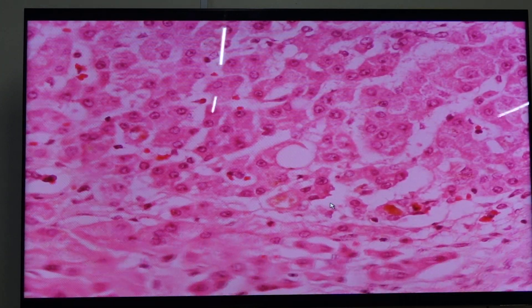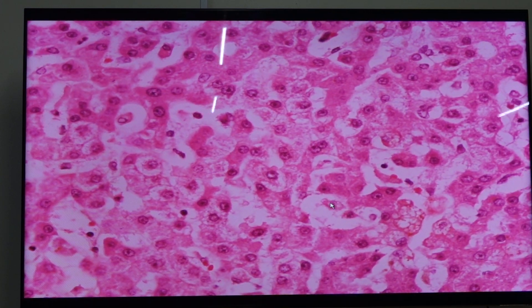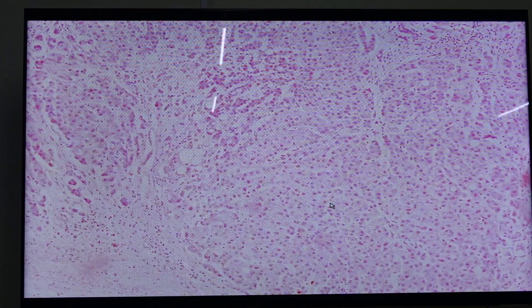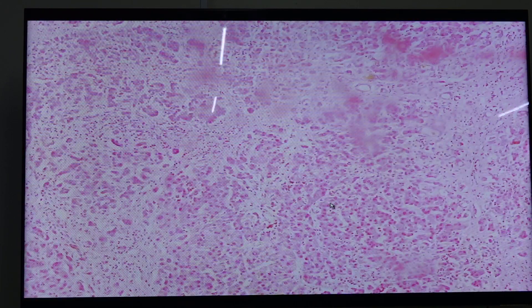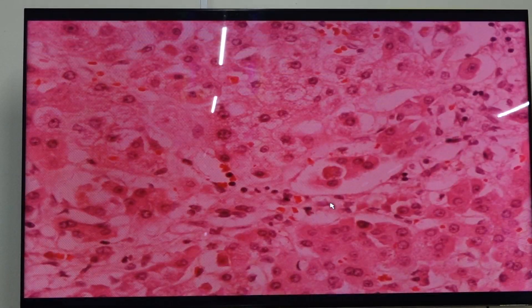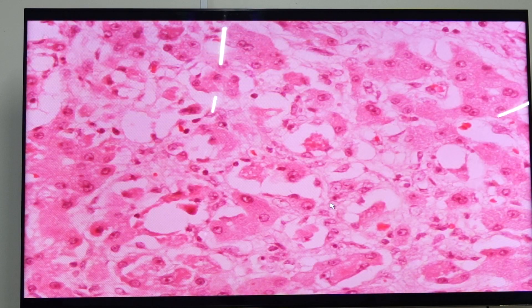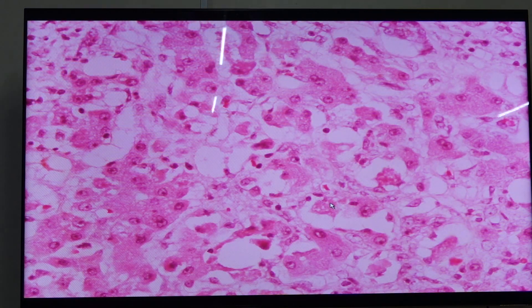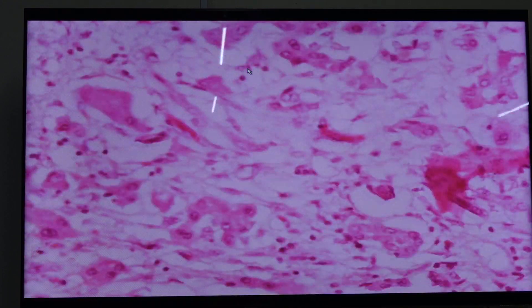The last feature for the second stage is Mallory-Denk bodies. Let's try to look for a Mallory-Denk body because it's important to be able to identify them. The Mallory-Denk body here would be these accumulations of pink cytoplasmic material that is composed of cytokeratins.